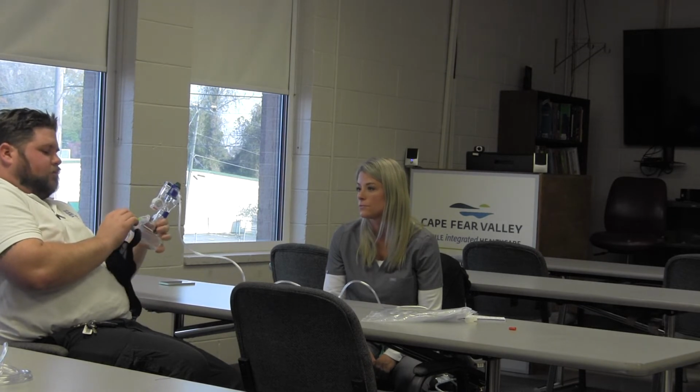I mean, we don't recommend it, because we've tried it with other masks and it doesn't have that good seal that that one provides. Those are adjustable to the forehead. Yeah, I was concerned about them breaking right there. So they don't break like the ones that we have now.